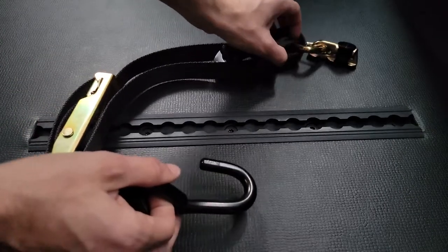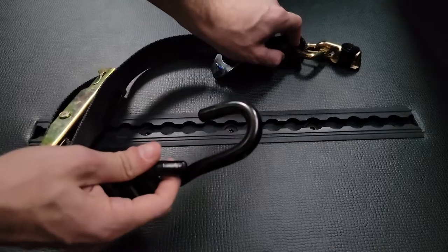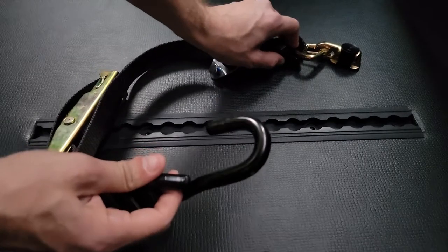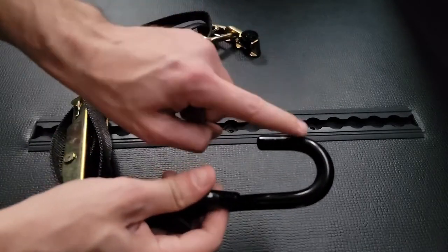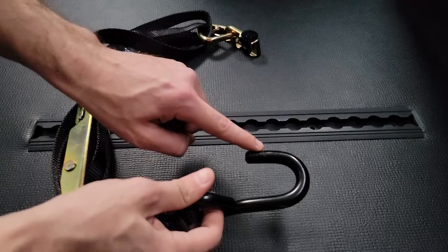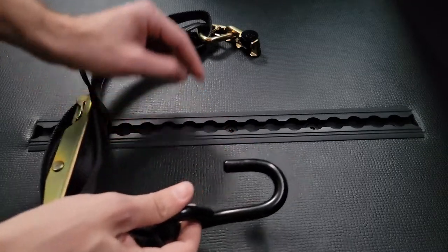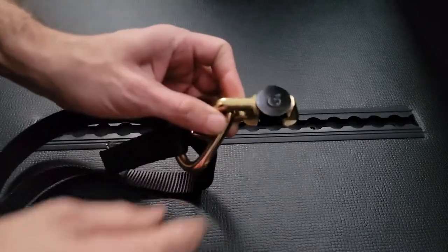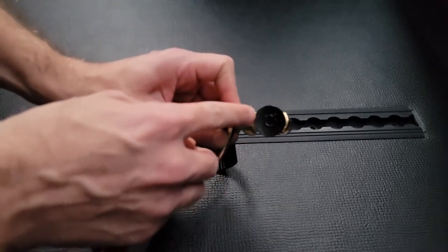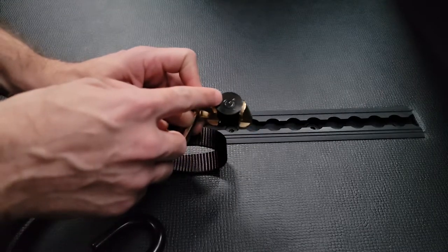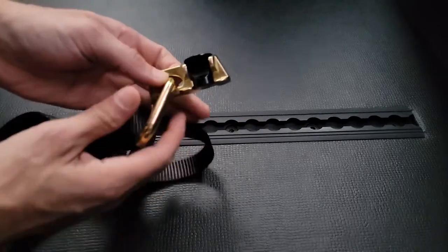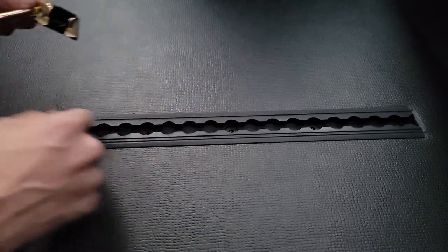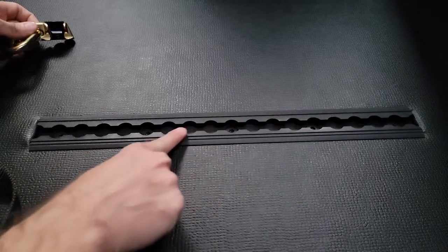Here we have a strap that attaches to an L-track. This piece goes on to the wheelchair that you're securing, and this piece goes to the L-track. Now how you attach it to this L-track here.